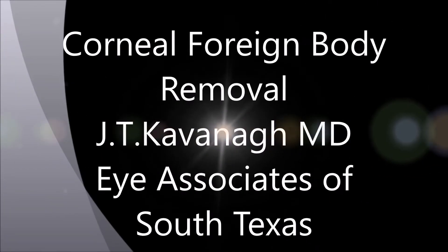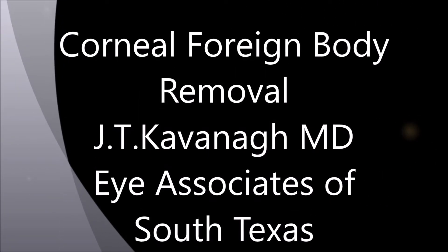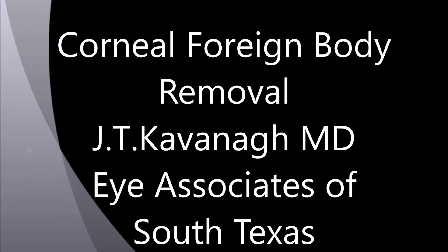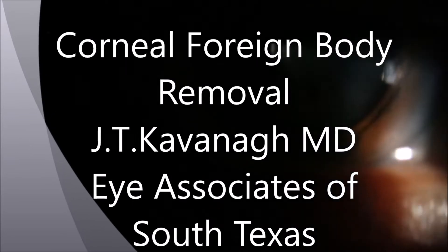This is Dr. Kavan of Eye Associates of South Texas. I'm going to show you a corneal foreign body removal with a 25 gauge needle.